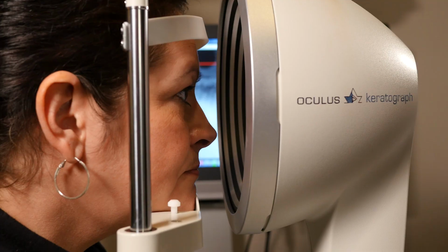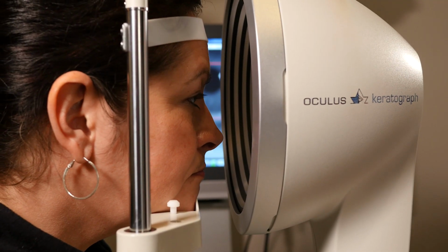Ultimately, my goal is to assess the patient's level of water, oil, allergies, inflammation, bacteria, lid function, systemic, environmental conditions. And more importantly, I need that patient to be able to visualize this and understand all these elements so that he or she is compliant with my recommended treatments. For this reason, the vast majority of my exam is done with the 5M.